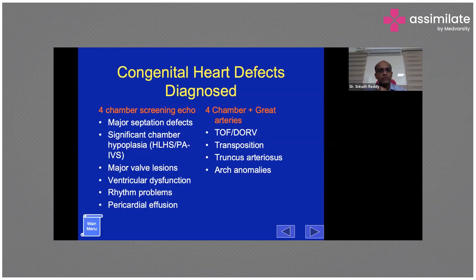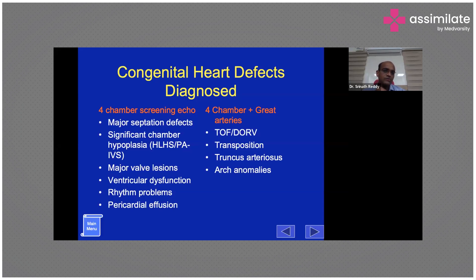In the four-chamber view, most congenital heart defects can be assessed. You can diagnose major septal defects — don't worry about ASD, but major septal defects like a single ventricle or large VSD are important. You can also diagnose ventricular disproportion where the RV and LV are not the same size — either hypoplastic left heart syndrome or hypoplastic right heart syndrome. Major valve lesions like tricuspid atresia and mitral atresia can also be diagnosed in the four-chamber view.